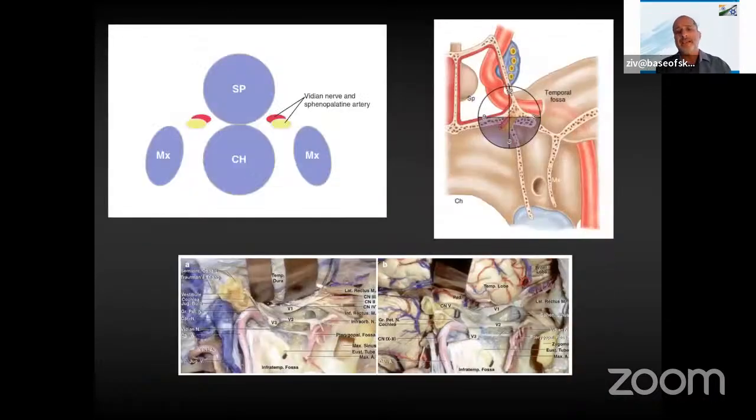How do we identify the internal carotid artery? The best way to identify it is through the vidian nerve and sphenopalatine artery. The vidian nerve, as you can see here, goes posteriorly into the area of the internal carotid artery. This is the vidian nerve, okay? So you find the sphenopalatine artery, find the vidian nerve, drill from 3 o'clock to 9 o'clock, go posteriorly easily with the drill, and then with the help of an endoscopic Doppler, you can find the internal carotid artery and continue the surgery from there.